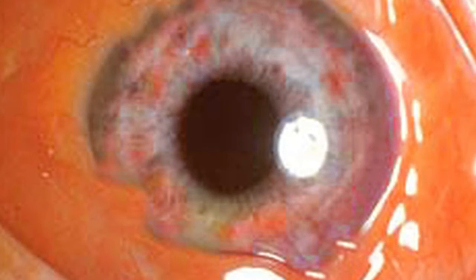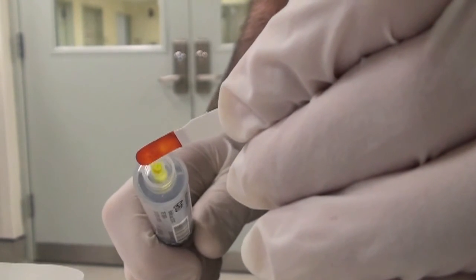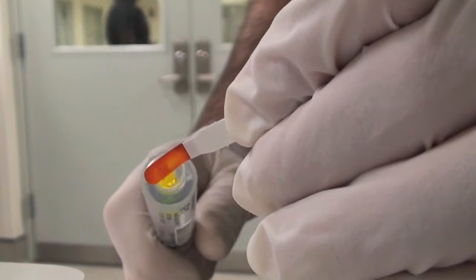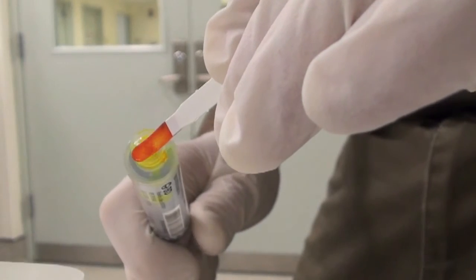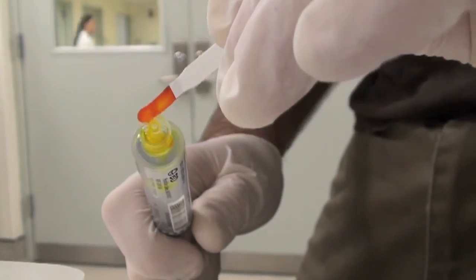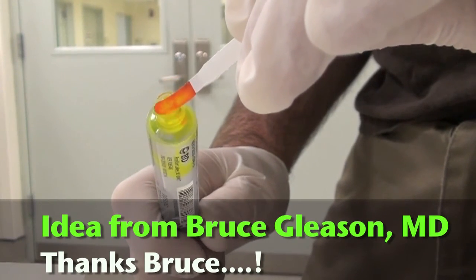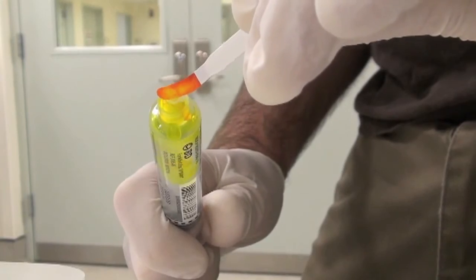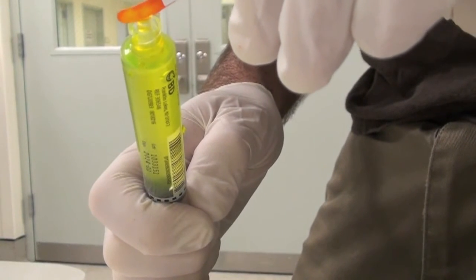Kids and some adults are terrified of fluorescein strips — they think you're going to give them a paper cut on the eye. In these cases, you can take a flush and dribble some of it onto a fluorescein strip, then aspirate the liquid back in. After repeating this a few times, you'll have a large amount of fluorescein-tinted saline in the flush that you can simply drip over the patient's closed eyelids and then tell them to open their eyes a little bit. Some of it will get in the eye, and you'll be able to do your fluorescein exam much more easily without people freaking out.